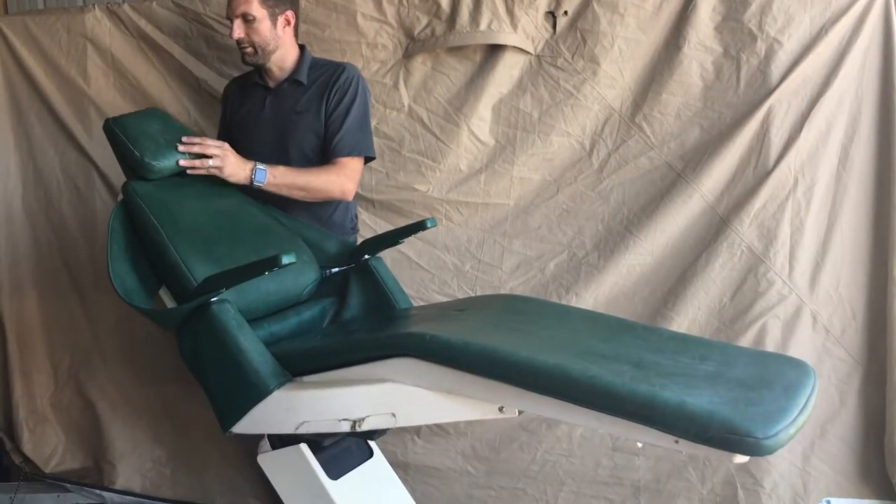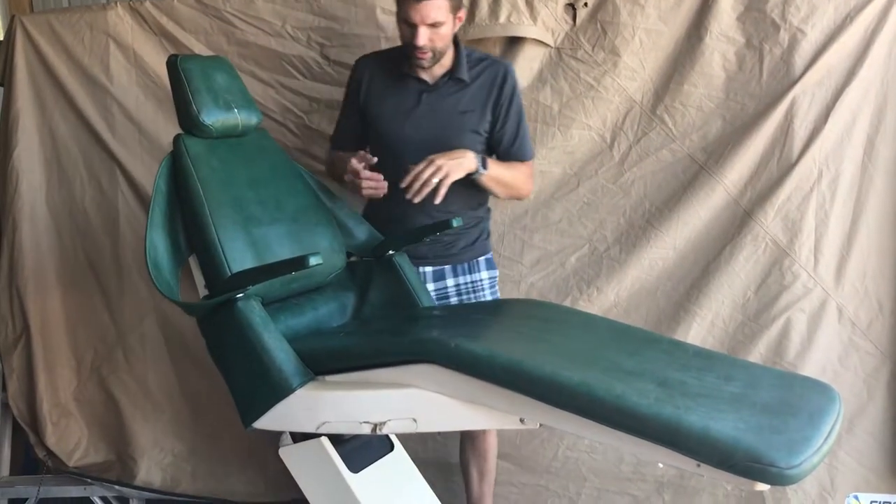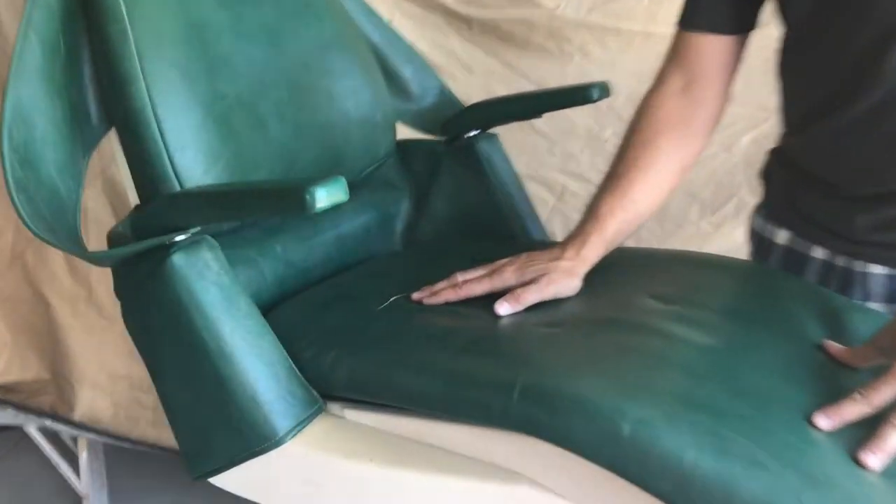The blemishes I'm going to point out: the headrest has some upholstery issues, the seat has a little bit — if you come on and take a look at that right there. And the side here has some trim that's come out.